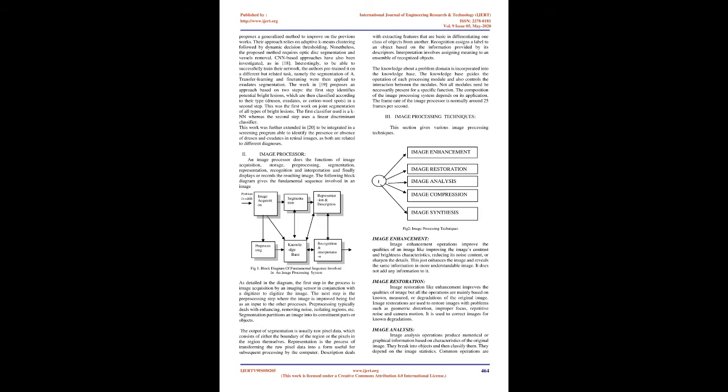As for MAs, a common approach is to identify candidates and refine the results through further analysis. For example, in 12-14, candidates extraction is achieved with morphological operations and the refinement by applying maximum entropy thresholding 13 or random forest classification 14. In 15, an alternative approach is proposed in which a random forest classifies each patch depending on the presence or absence of lesions. Positive patches are then fed to a segmentation module that refines the boundaries based on local variance, size, and local contrast.